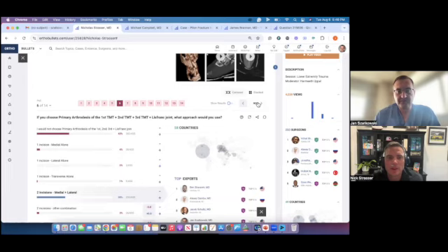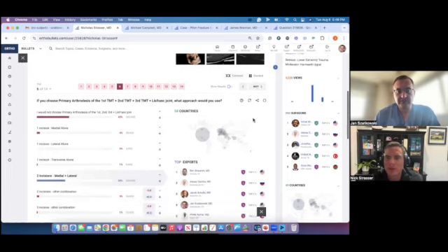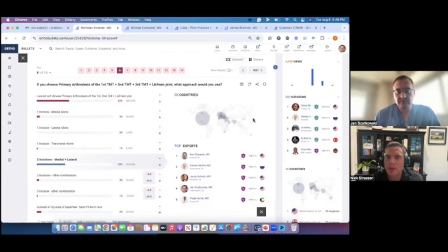But I do kind of rely on, I don't know if it's a paper yet, but Lyndon Mason has talked about that. They did a project looking at fourth and fifth TMT joints and whether or not they were necessary to be pinned. I don't think we need to be as aggressive with fixation there. We want that joint to move quite a bit on the lateral side, so if you fix it with anything, it's going to get stiff. Yeah, and I've not seen that paper, but I know I've seen his preliminary results, and I think he had an abstract. Yeah, I think that's it.